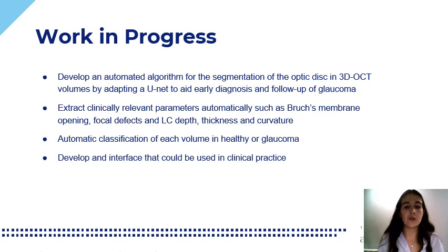But my goal in the end is to provide an automatic segmentation that can hopefully fill some of the gaps left by the existing methods, and then can be, for example, improved in the segmentation or in the validation with more instruments in the algorithm. After obtaining the segmentation, I want to extract clinically relevant parameters such as the Bruch's membrane opening, focal defects, lamina cribrosa depth, thickness, and curvature, and then use these parameters to provide an automatic classification of each volume as either healthy or glaucoma. Finally, I want to develop an interface that can easily be used by doctors in clinical practice.